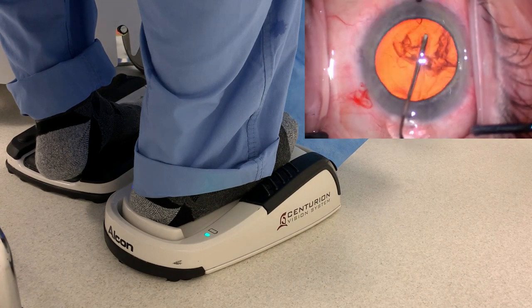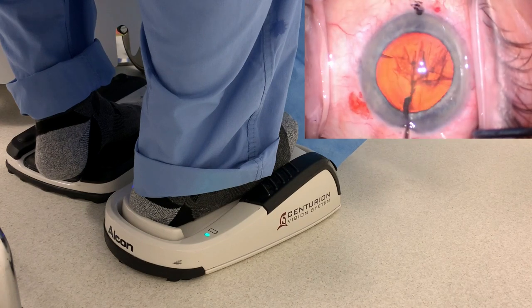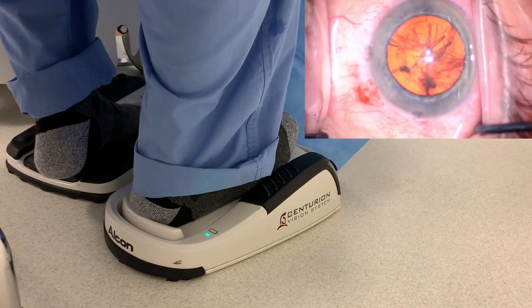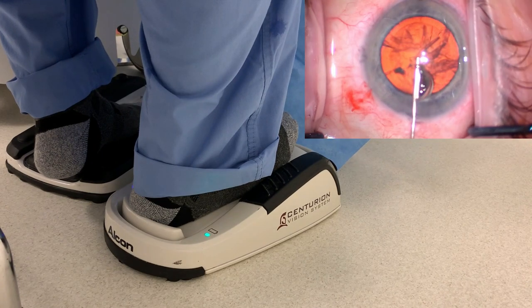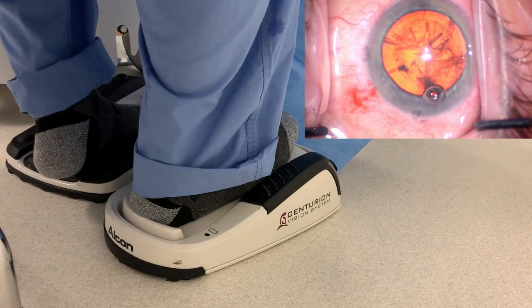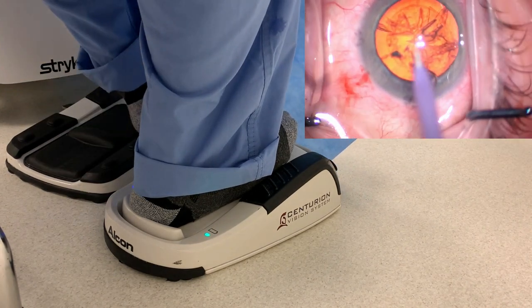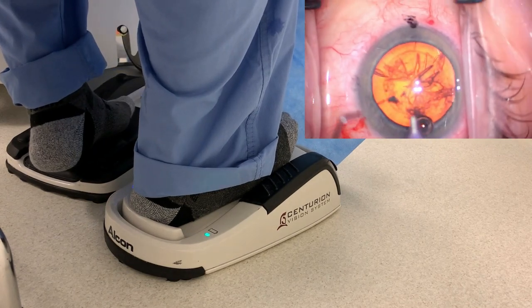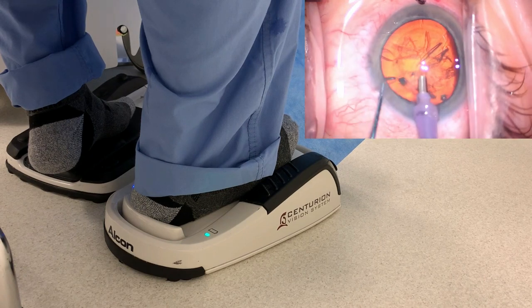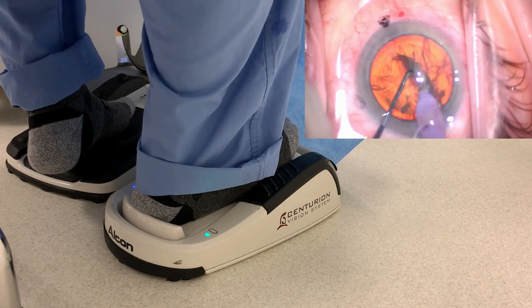Here's our hydrodissection. Everything is looking good. I'm going to show you the entire case unedited — I think there's good learning potential in seeing everything. Now here comes the action. We're going to get the phaco probe in the right hand, chopper in the left. You can see I'm already centering up the scope, preparing for this, adjusting the focus if we need to. Now, stepping on pedal position one, get the chopper in the eye. Buzz in, I step on the pedal, and chop.